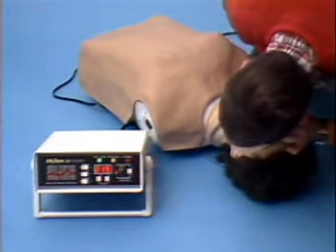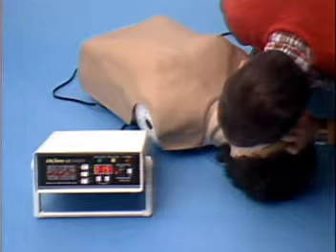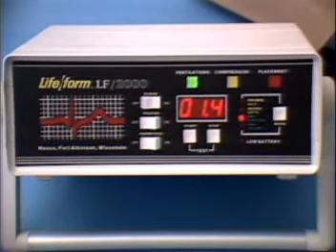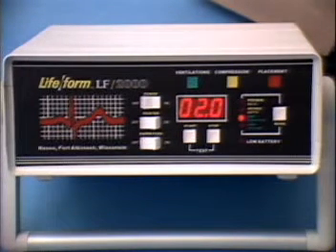Now, as the trainee begins ventilations, the memory unit automatically changes to the ventilation mode by displaying the duration of each ventilation as measured in seconds. The ventilation duration should be monitored to avoid gastric distension. The green ventilation light will continue to come on when the proper volume of air is ventilated into the lungs. Ventilation time of each ventilation is displayed instantly.